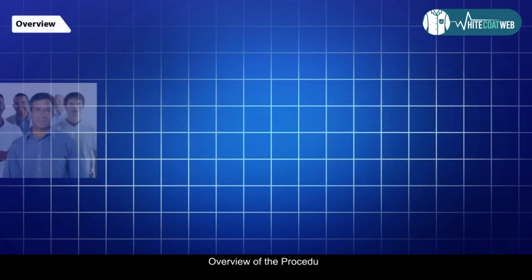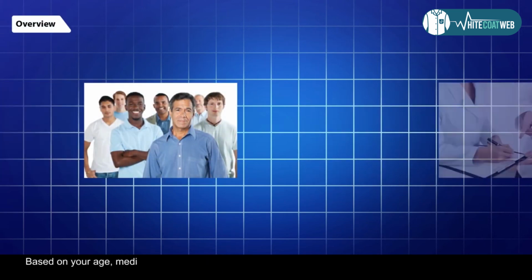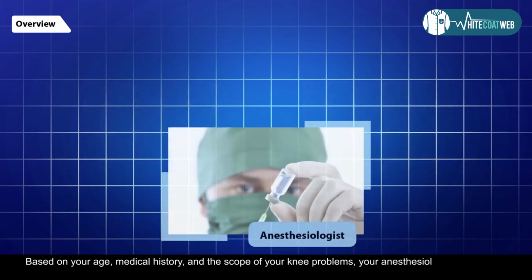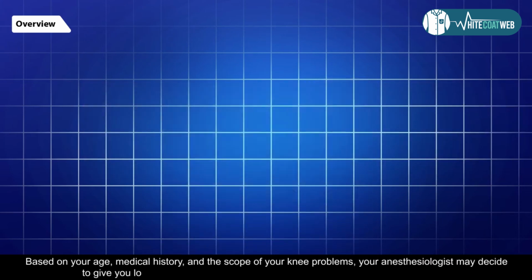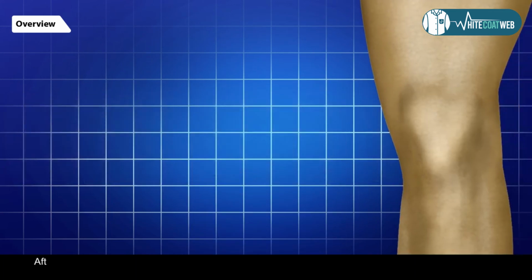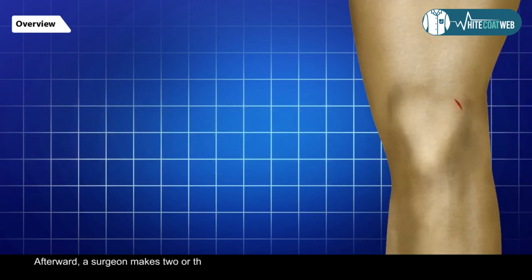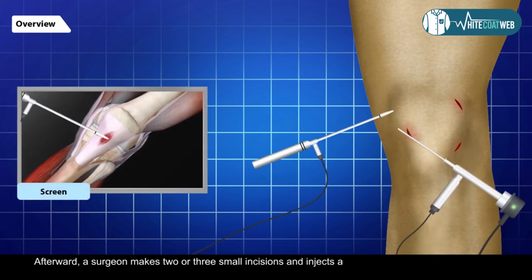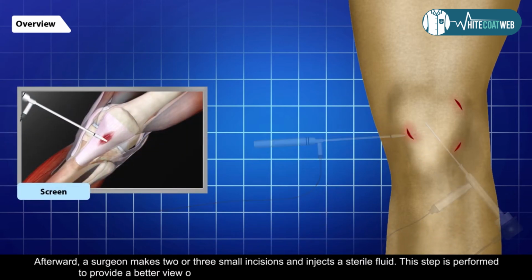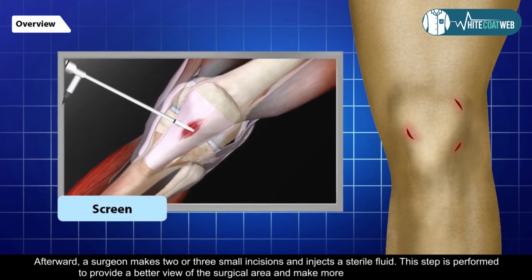Overview of the procedure. Based on your age, medical history, and the scope of your knee problems, your anesthesiologist may decide to give you local, spinal, or general anesthesia for the knee arthroscopy procedure. Afterward, a surgeon makes 2 or 3 small incisions and injects a sterile fluid. This step is performed to provide a better view of the surgical area and make more room for the procedure.